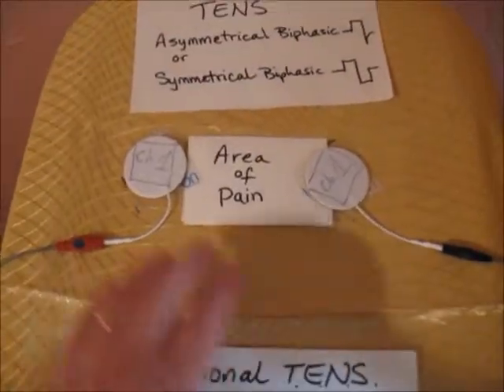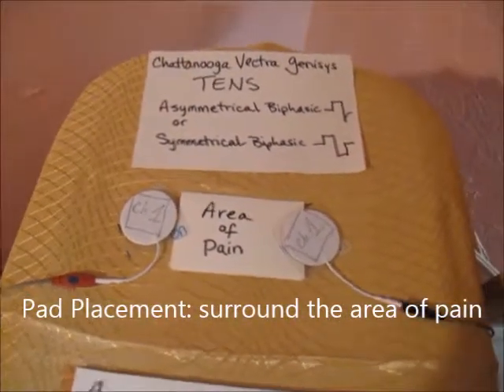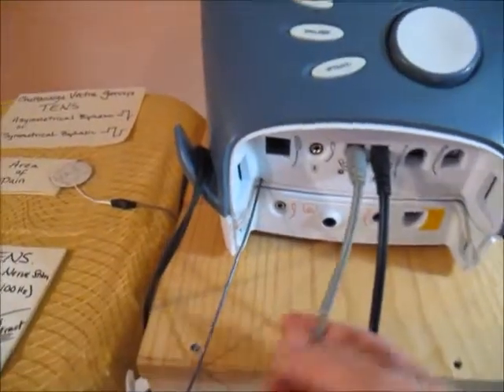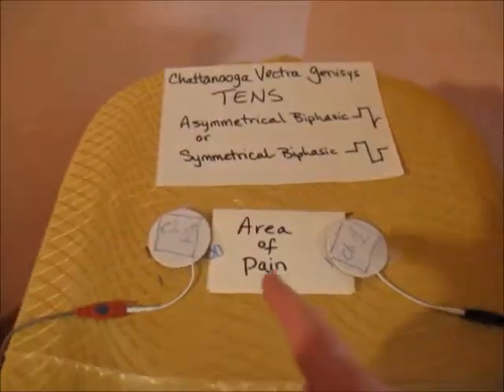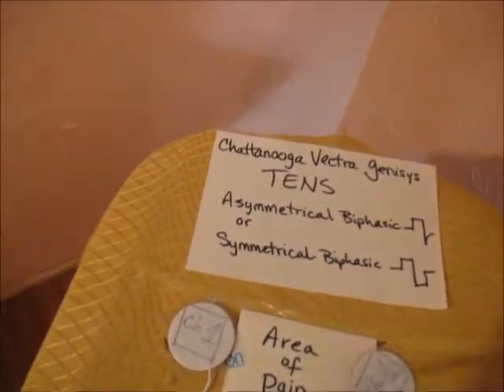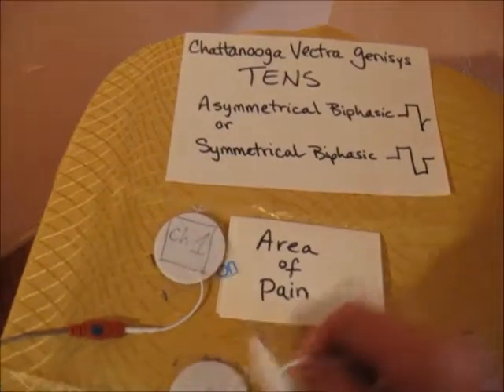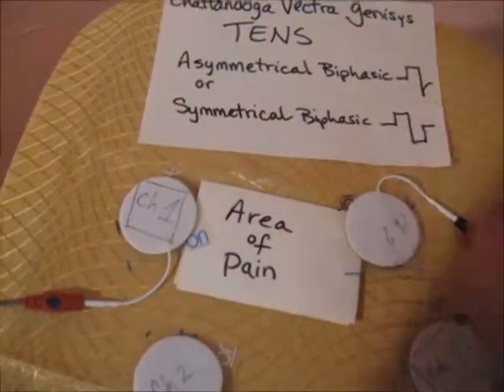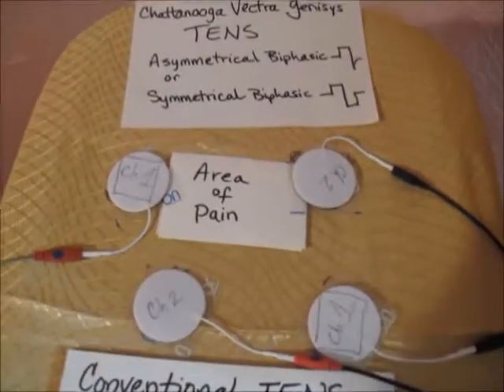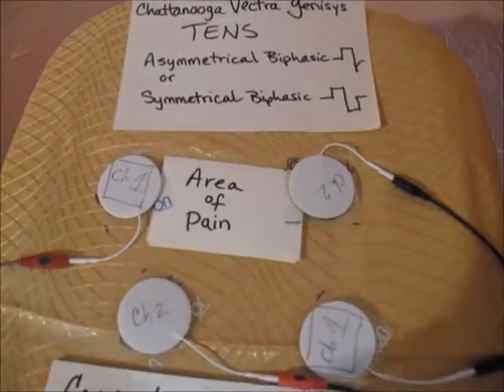The pad setup is to surround the area of pain. If using one channel — like channel 1 with the grey lead — you place the pads around the painful area. You can set up two channels but on this unit you will need to set them up separately, whereas on smaller units you can set them up to run at the same time. A criss-cross setup is called interferential, but don't confuse that with interferential of medium frequency.